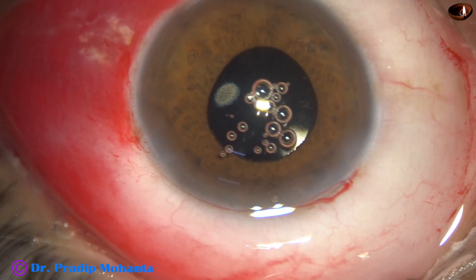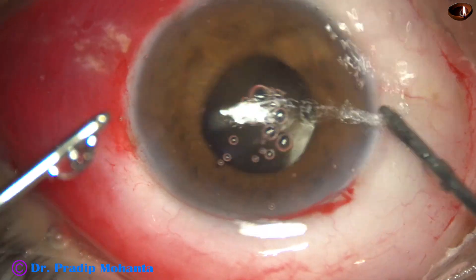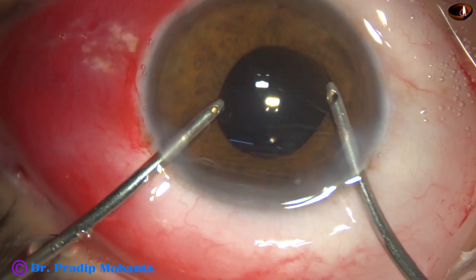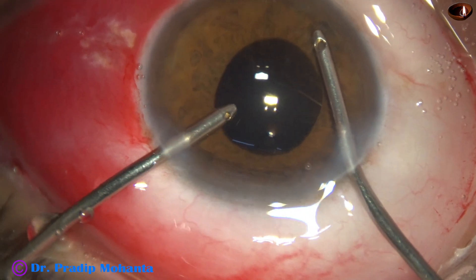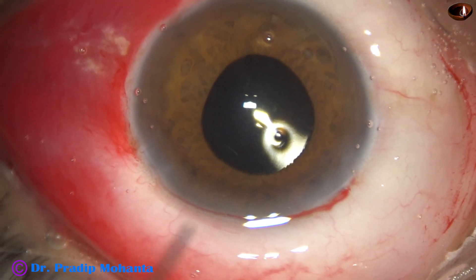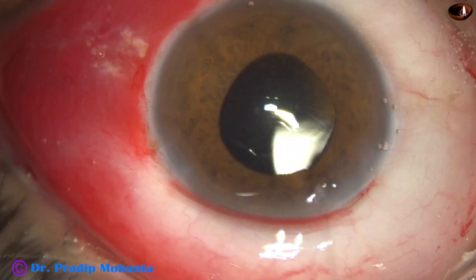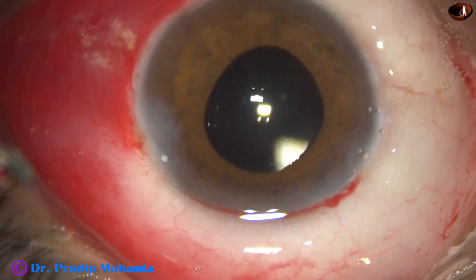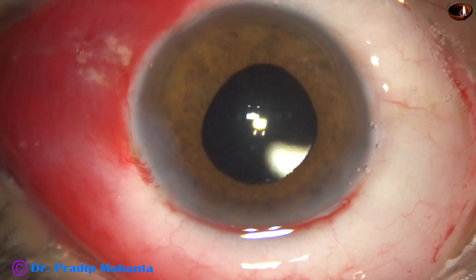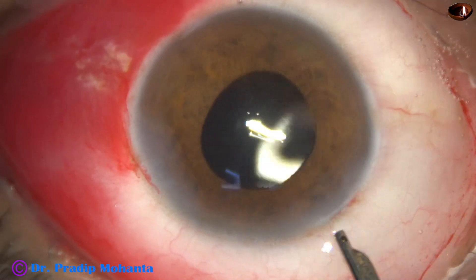Take the bimanual irrigation aspiration to remove the visco from the anterior chamber completely. Then a bit of moxifloxacin is injected. The side port is closed by hydrating the corneal stroma, and finally a lavage is done.